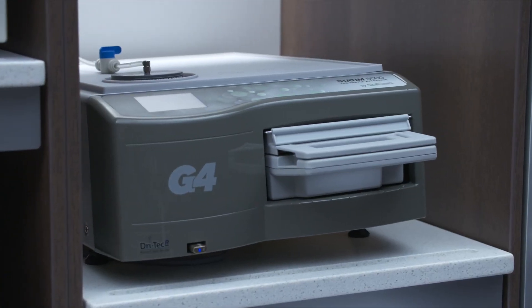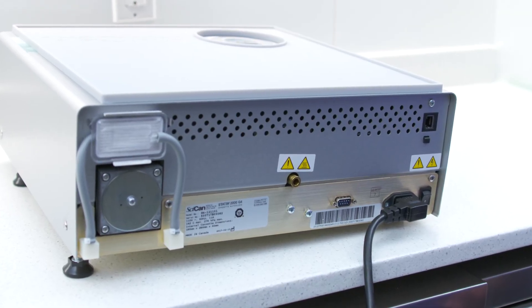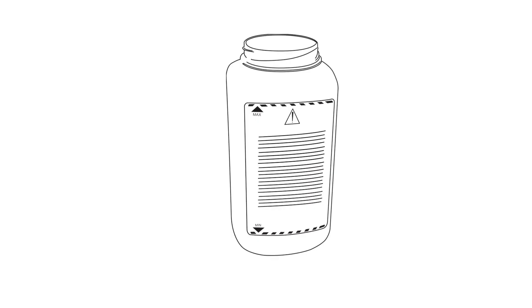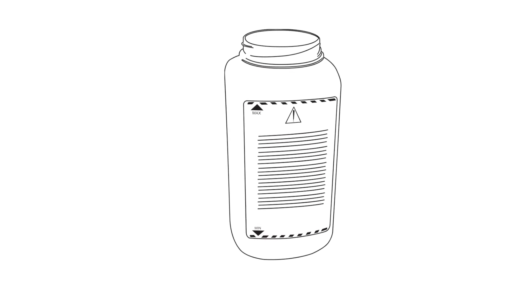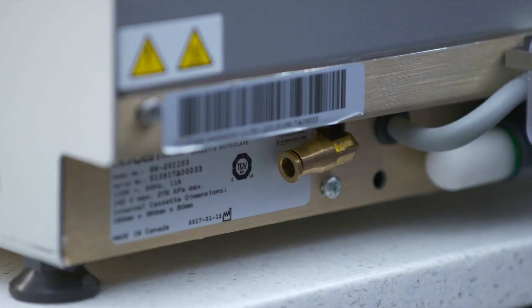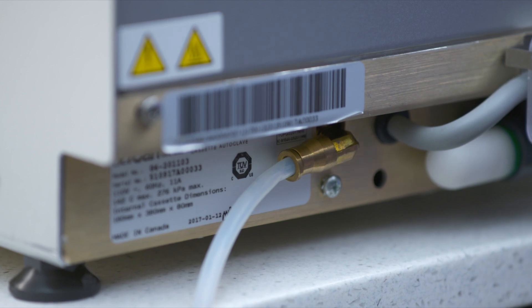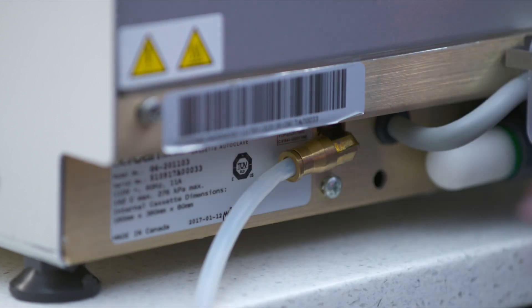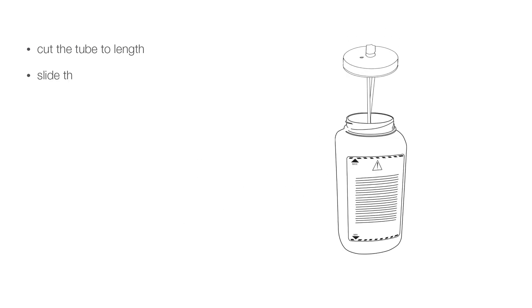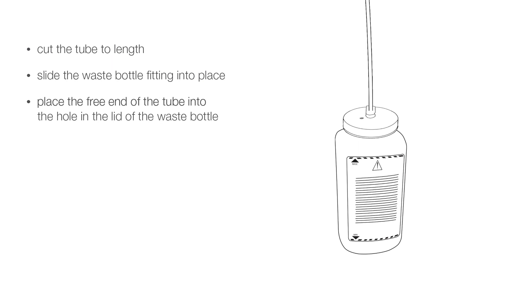When installing your STATUM unit, ensure the vents and openings on the STATUM remain uncovered and unobstructed. The waste bottle is used to collect waste water after it has been converted to steam and drained from the cassette. To connect the waste bottle, insert the exhaust tube into the fitting on the back of the unit and pull gently to confirm a tight fit. Cut the tube to length and slide the waste bottle fitting into place. Place the free end of the tube into the hole in the lid of the waste bottle and hand tighten the fitting.